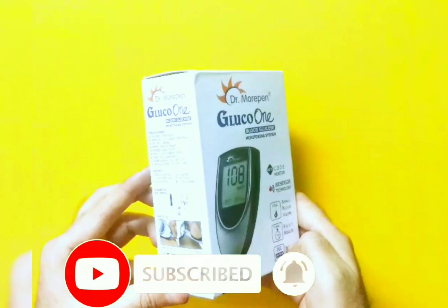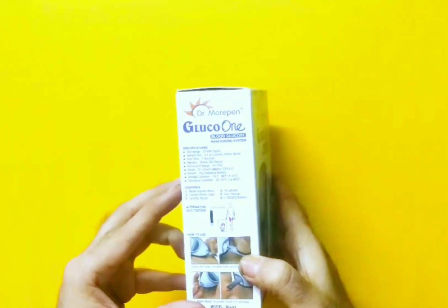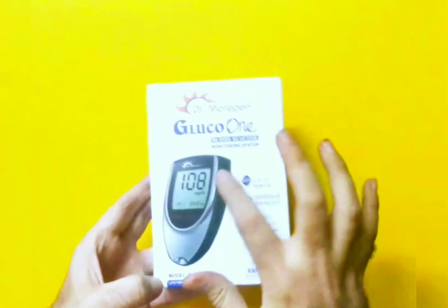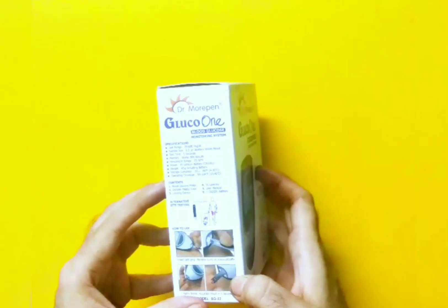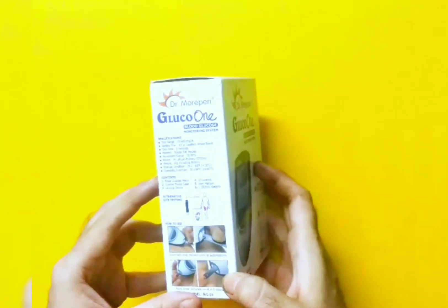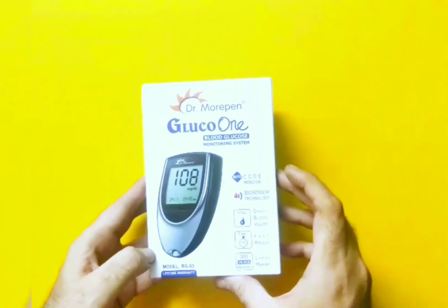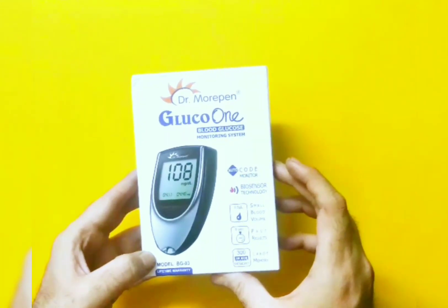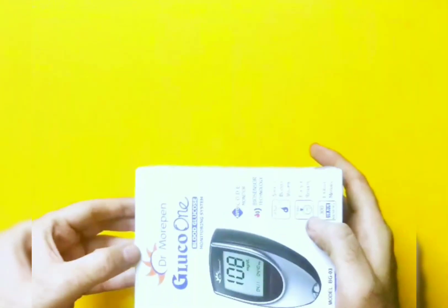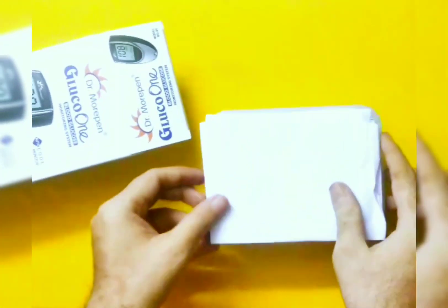You can refer to results later on. It comes with a lifetime warranty in the model BG03. In the box you'll also have around 10 lancets, the main glucometer, a lancing device, a user manual, and a battery which will be added to the meter. Test strips are something which we'll have to buy separately.